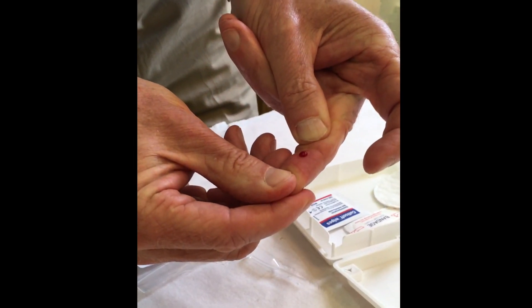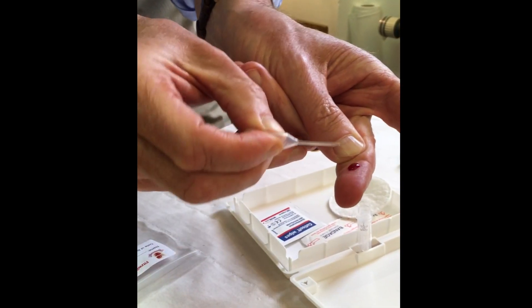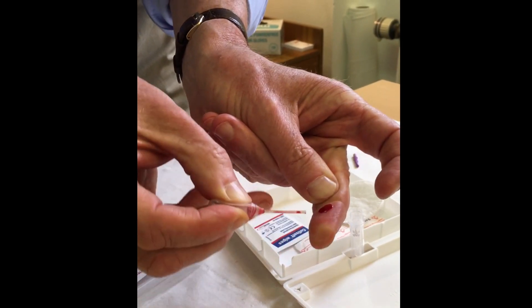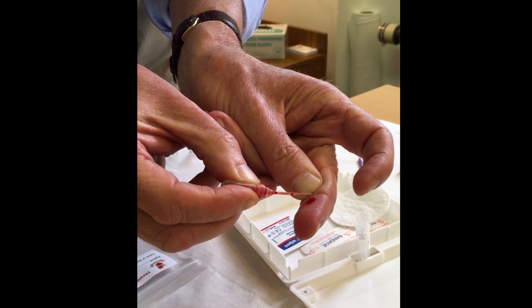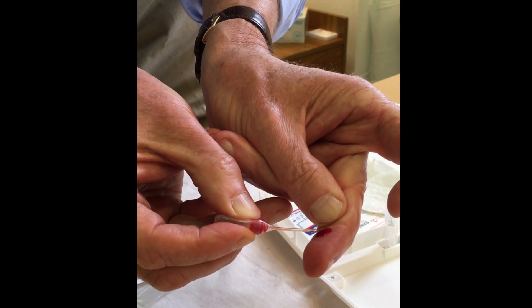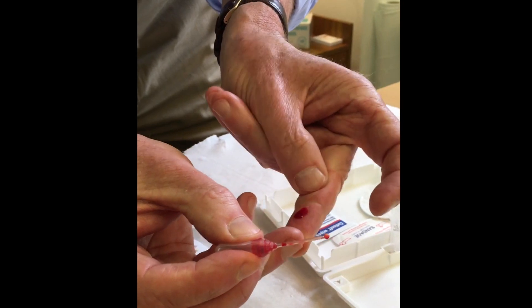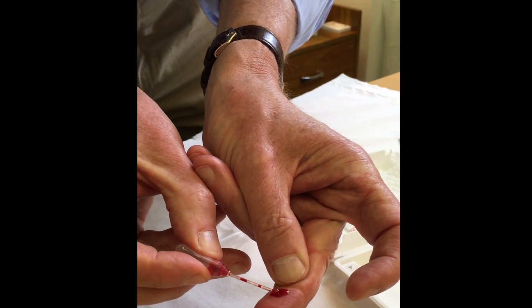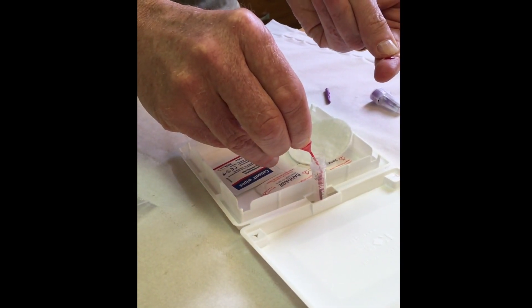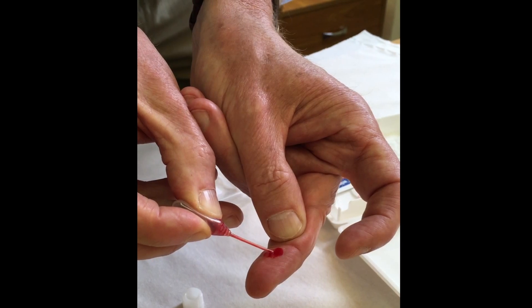First of all, massage the finger, then bring the capillary tube — squeeze and draw up that drop. Keep massaging the finger, slowly releasing the bulbous head of the capillary tube. Drop those into the tube, keeping it closed, then come back for the next drop, slowly releasing the head of the tube. Keep pumping and massaging the finger to bring up the drop of blood.